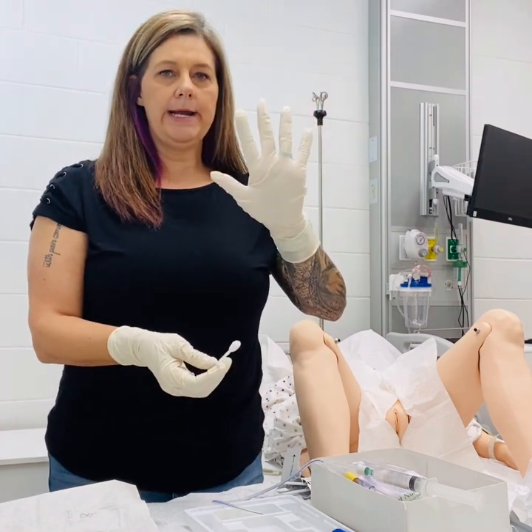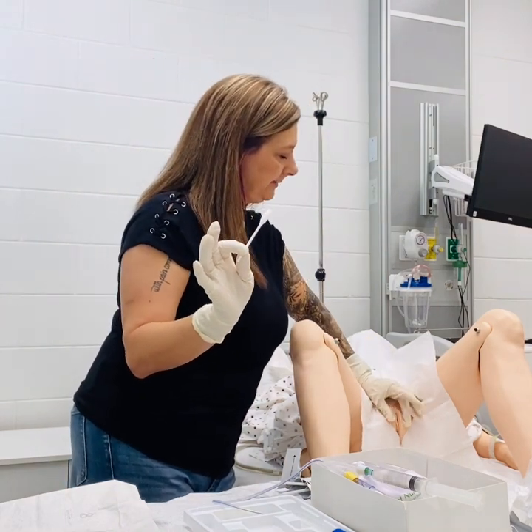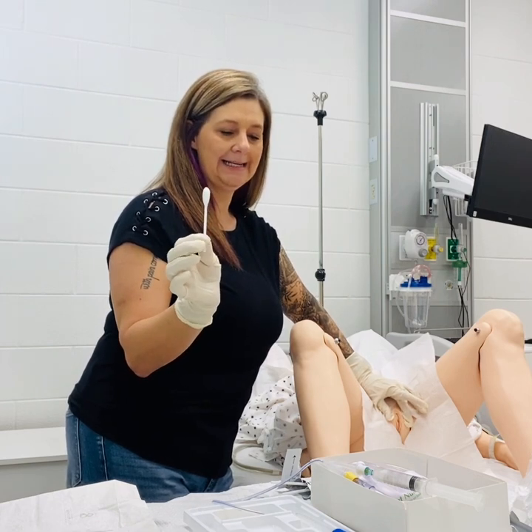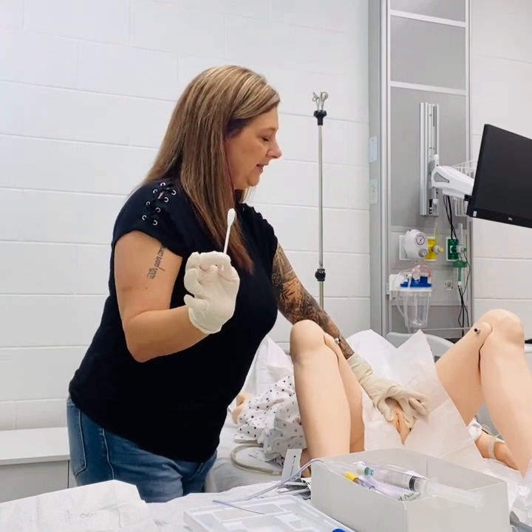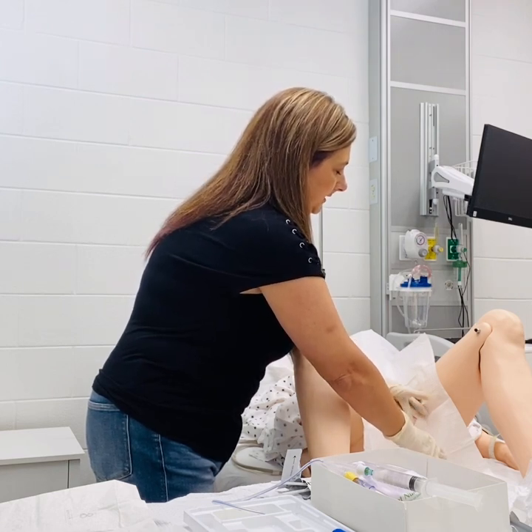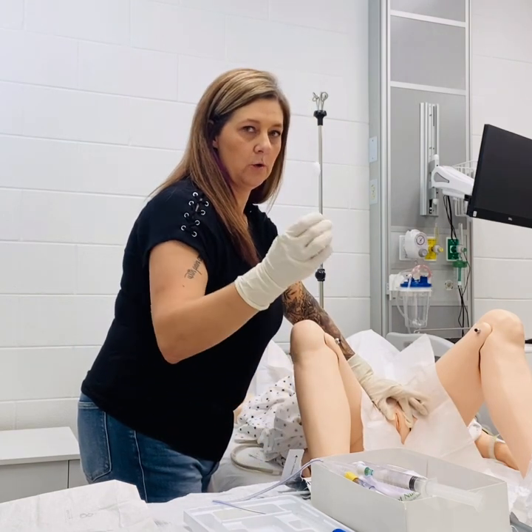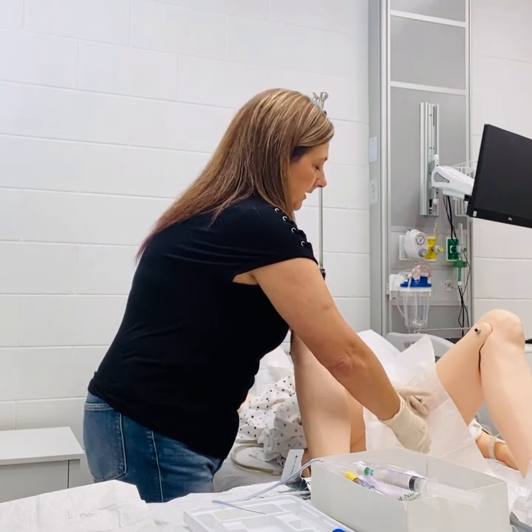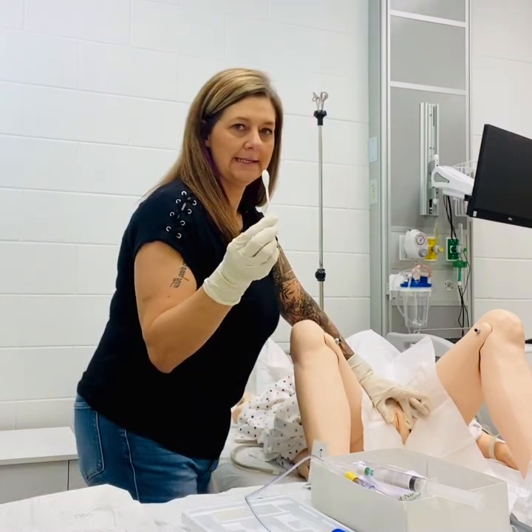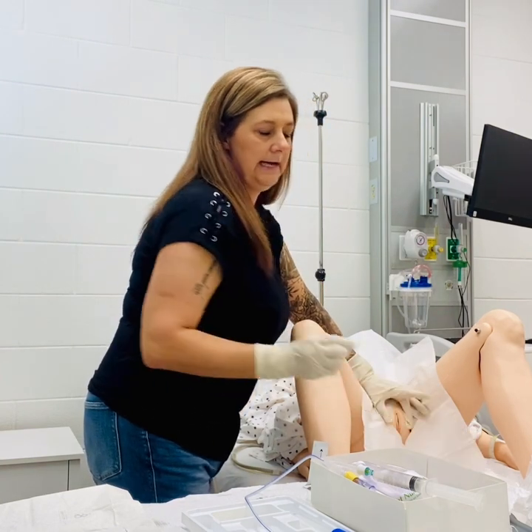One hand will become dirty, one will maintain sterile. We'll take this hand and place it on the patient's labia and open up, and then we're going to begin cleaning. We'll take one betadine stick at a time, starting with the area furthest away from you. We'll do the left side from proximal to distal, and then toss this in the trash. Second, we'll do the area closest to me, proximal to distal on the right side, and toss that. Then I'll use my last swab and go from center to bottom, and toss that.